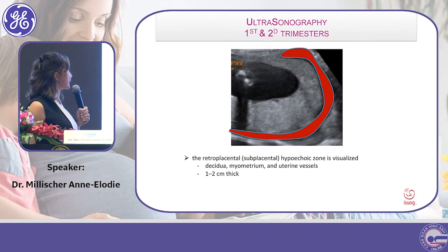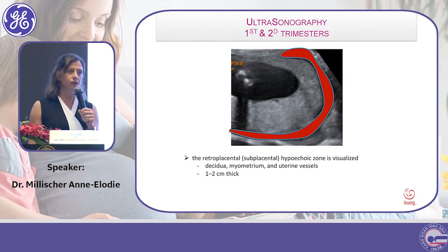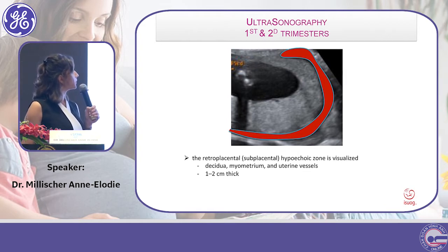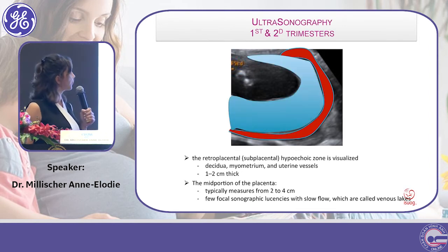And we'll see that the interface between the maternal plate, the maternal side, will be very important to better diagnose the morbidly adherent placenta.